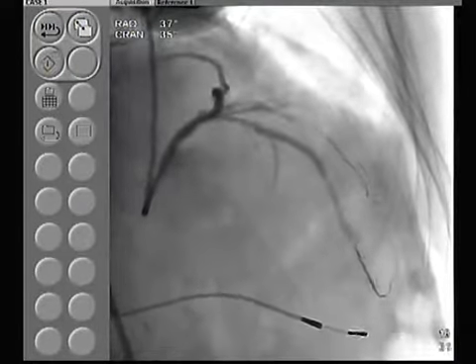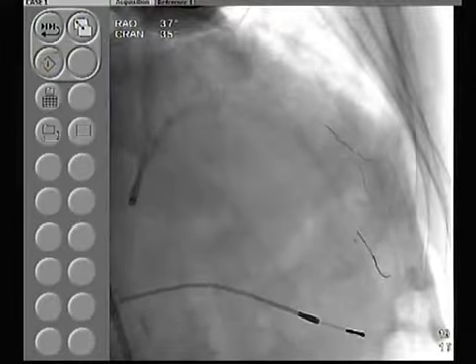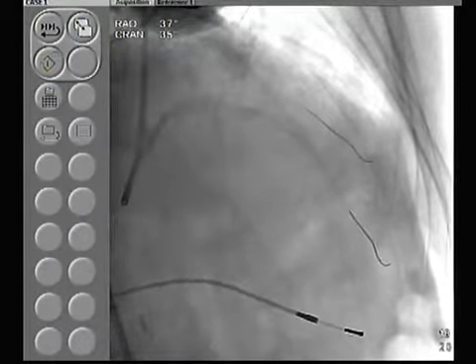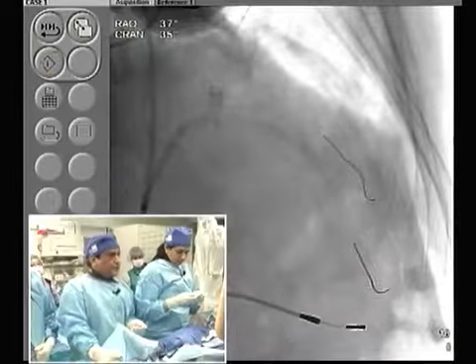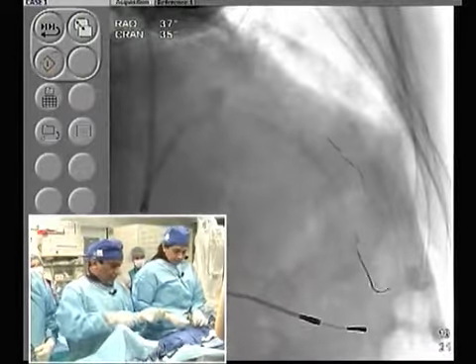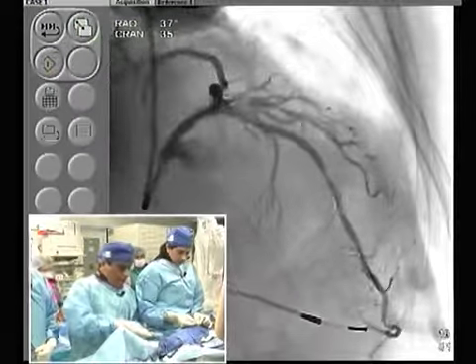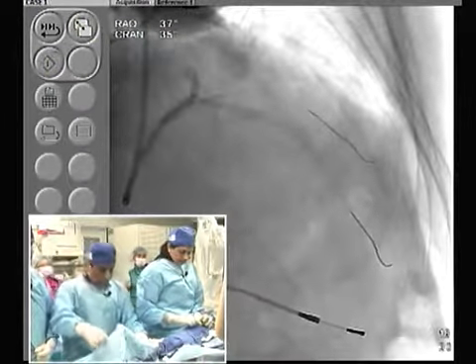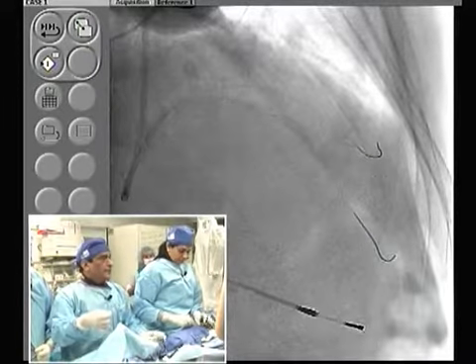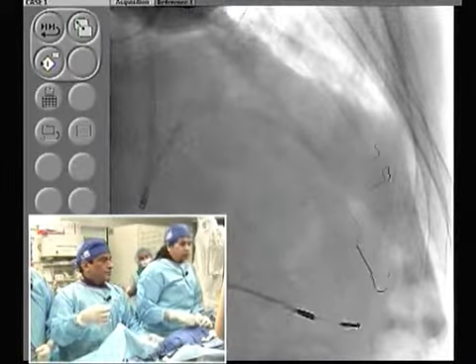We put a stent in the mid to distal LAD. I think we need to, unless this goes into a distal portion of the diagonal. Let's see quickly and we'll decide. You're right that in this particular case, if you need to put a stent in the mid to distal LAD, do it now rather than going through the complex V stent technique. But we'll see where it is.